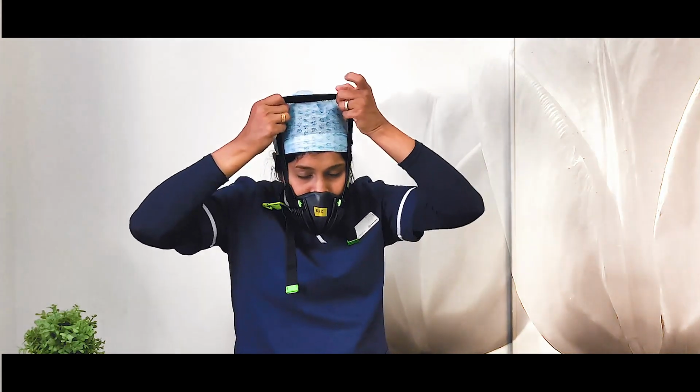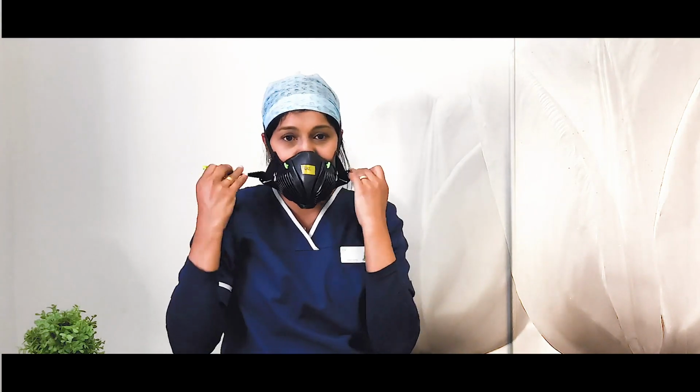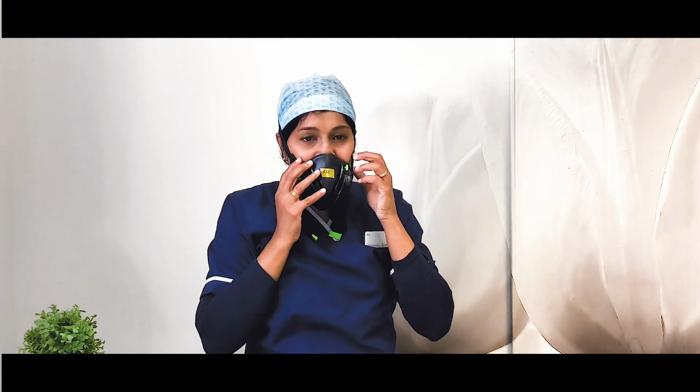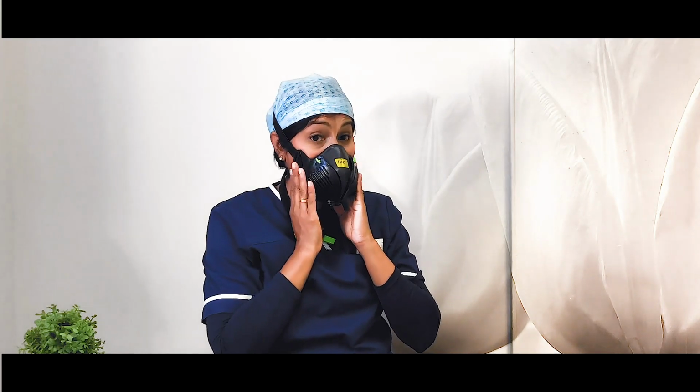And I fit tested for this. So all you do is you put it from the bottom of the face there, on the head there, and then this bit that we have to tie and adjust, and then you just put it tight, and as you can see, it's quite tight, and I can wear my loops with this.